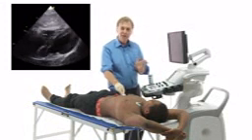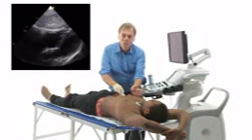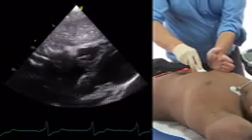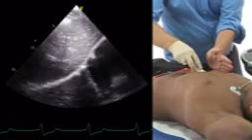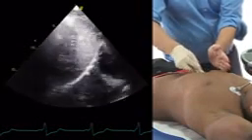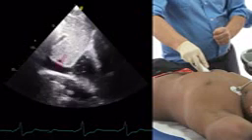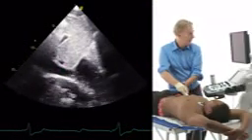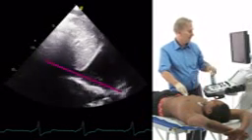Now remember, the inferior and superior vena cava is located more to the right of the body. That's why we also have to turn the transducer more to the right, and at the same time rotate the transducer so we get in a longitudinal axis. And thereby you will then find a view right here where you would see the inferior vena cava. Now the orientation of my probe is in a longitudinal direction, and that's also the direction that the inferior vena cava obviously runs.